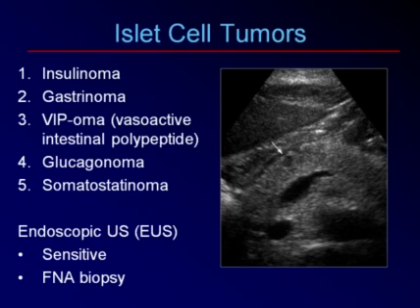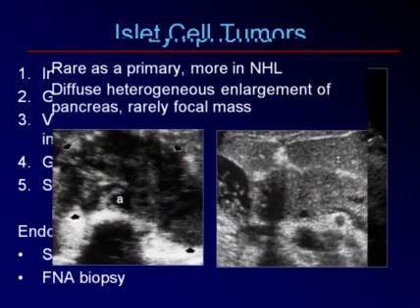So what happens is the surgeon has the abdomen and retroperitoneum and the gland exposed. We come to the operating room, glove up, dress up in sterile technique, cover the probe, and then run our probe over the surface of the gland after they put a little saline in, of course, and then we can sometimes pick up a very small tumor with our high-resolution laparoscopic probe. In some cases, we can't even find it. Sometimes the surgeon just does a blind kind of a resection.